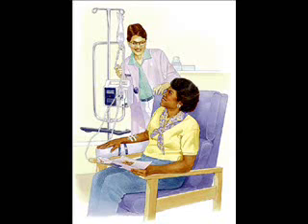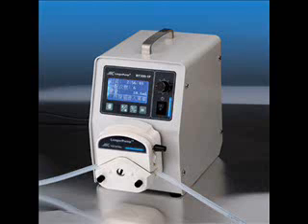Infusion pumps offer significant advantages over manual administration of fluids, including the ability to deliver fluids in very small volumes and to precisely program rates or automate intervals. They can deliver nutrients or medicaments such as insulin or other hormones, antibiotics, drugs, and pain relievers. There are many types of infusion pumps, including peristaltic infusion pumps.